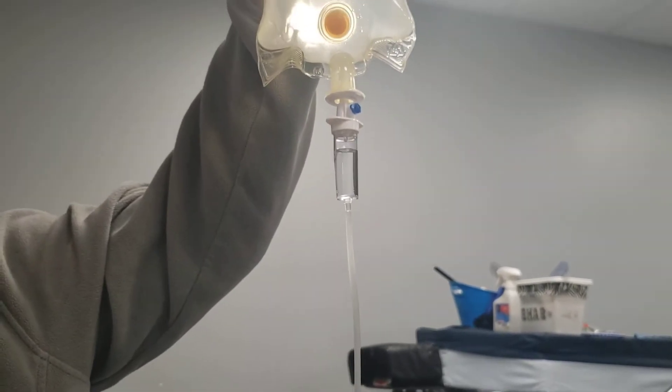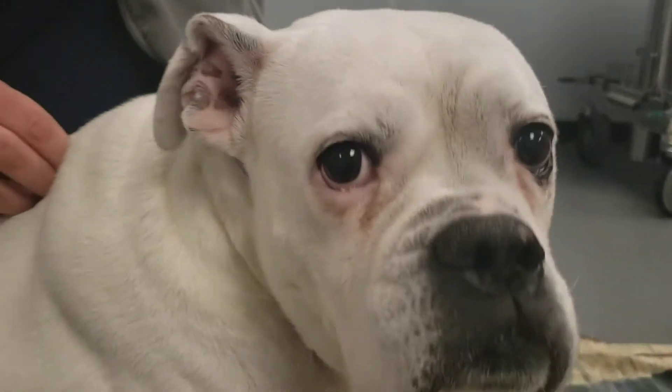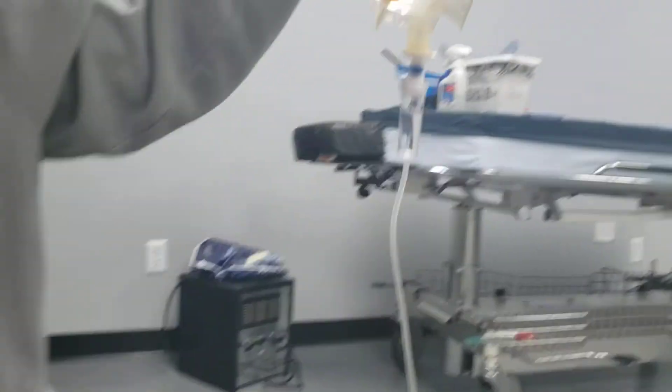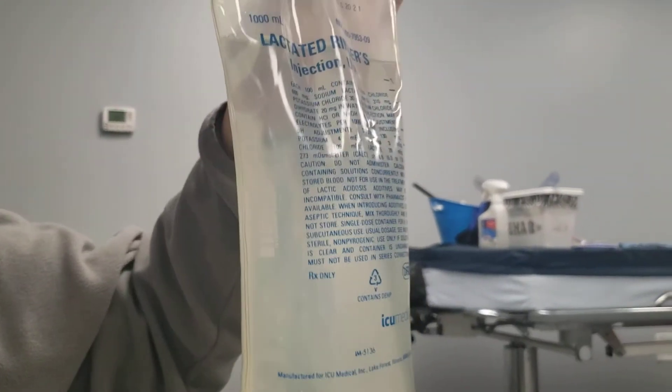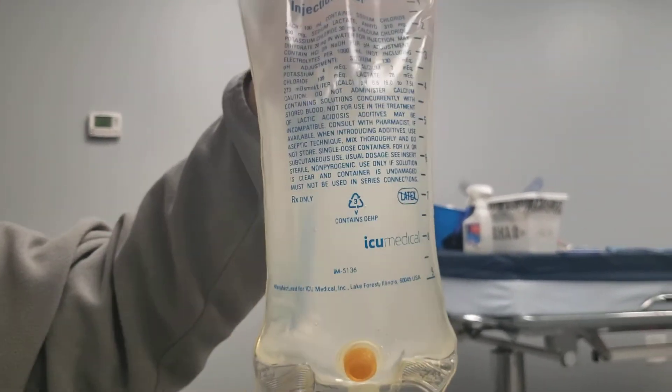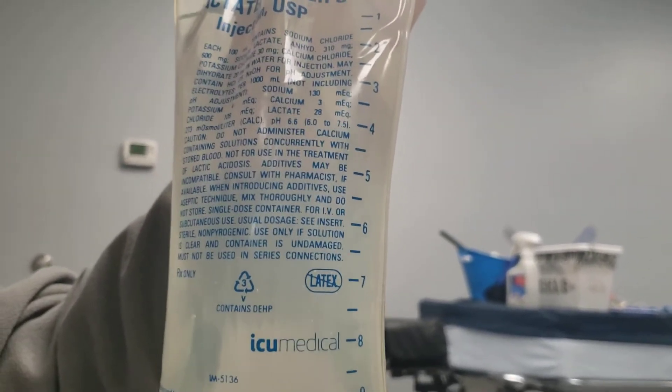If you can hold it up higher, and she's being really good like she is right now, that is the best. On the bag you'll see lines. Right now we're starting above the one, and Dr. Kitson will give us an amount of fluids to give. You'll just want to make sure you look at where you're at before you start to give the fluids.